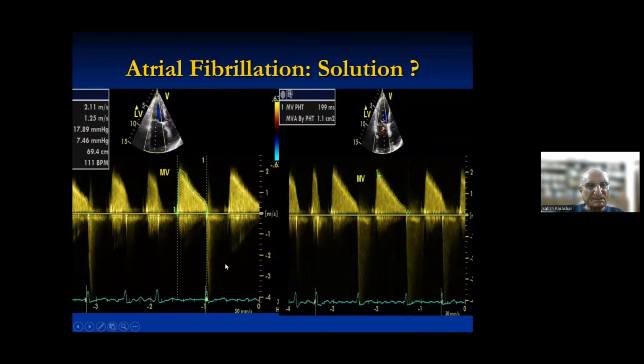But during the recording, there is bound to be a complex with a wide diastolic slope. So keep one finger at the stop button, so that as soon as you get a recording with a wide diastolic slope, you stop it. So here you see nothing can be done. And again here we have one flow, and you find the pressure half time is 199 and the area is 1.1.